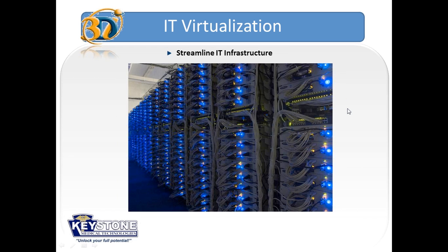What we do in order to decrease the need for very strong hardware is archive the images compressed, and then images are loaded faster in streaming mode, and the volume of memory that is needed is decreased as well. Excellent. Thank you, Sharon. So, Tommy, I'm going to pass things back over to you, back to the presentation.